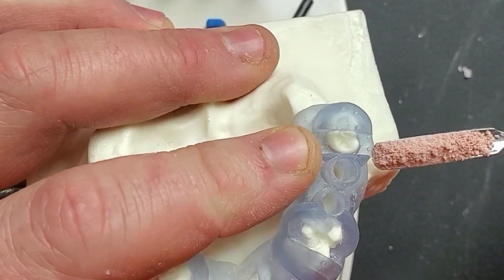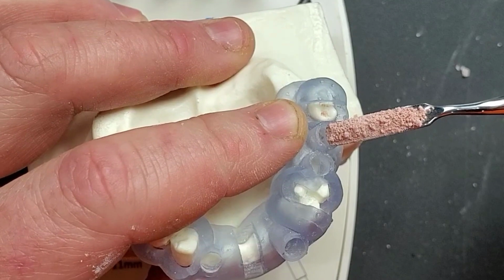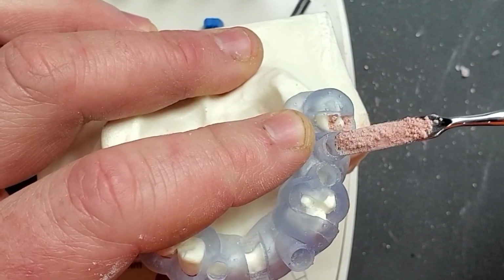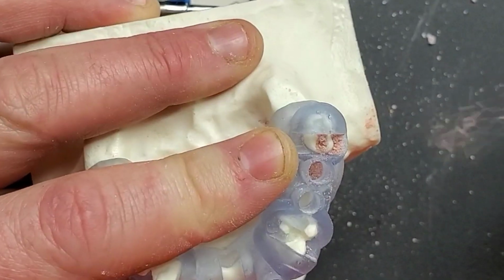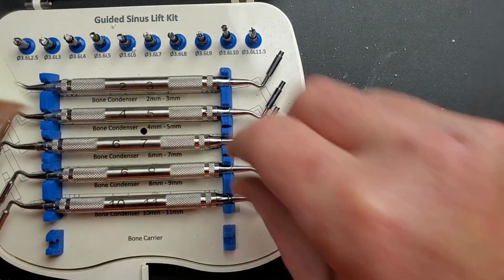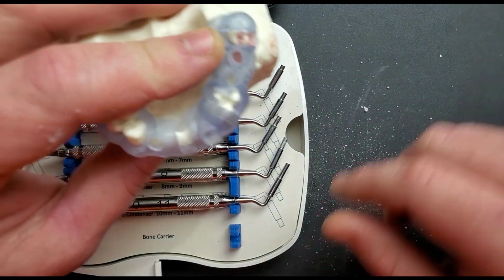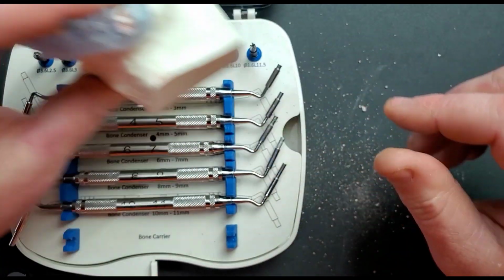All right, so if we were doing it by this method, you would just take this, and usually I would have an assistant holding this, and I would just use a graft packer to rake that off into the osteotomy site. You don't want to go too much at any one time. If you go too much, then that makes it very difficult to compact. And so I've filled this up about halfway, and now we'll begin compacting that.